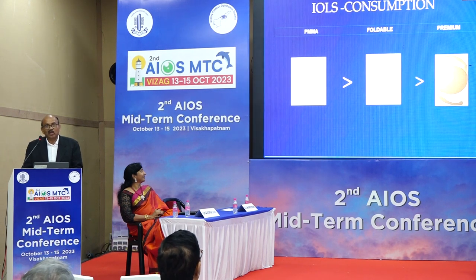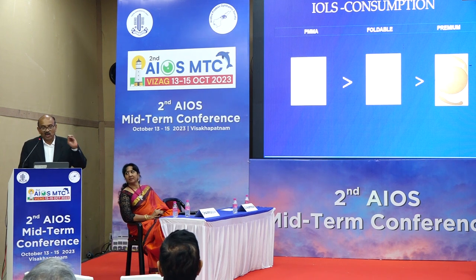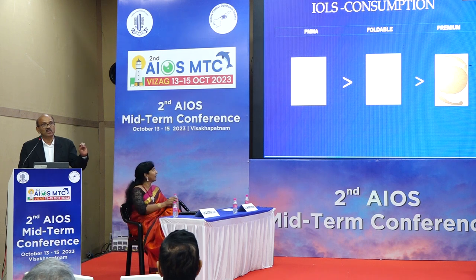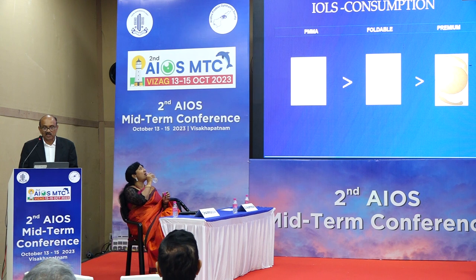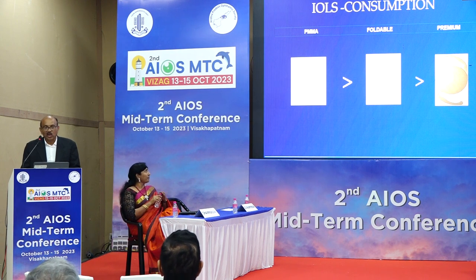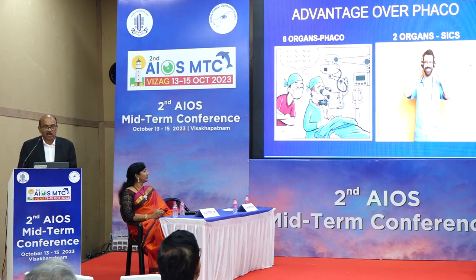For the IOLs, you need not stick to PMMA. You can shift to foldables. You can shift to premium lenses with SICS. The notion is that with SICS, the lens should be PMMA, but it need not be. The advantage of foldable lenses is no PCO. If you implant hydrophobic lenses, there is no PCO. You can compete. I can also implant premium lenses.